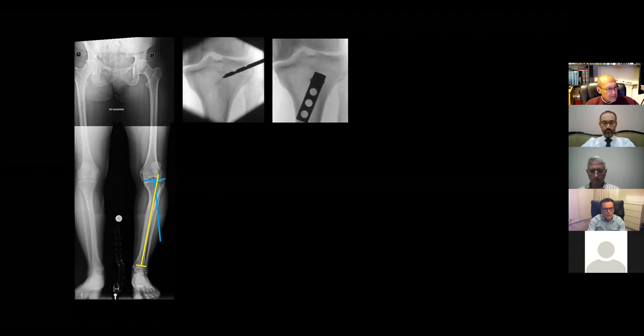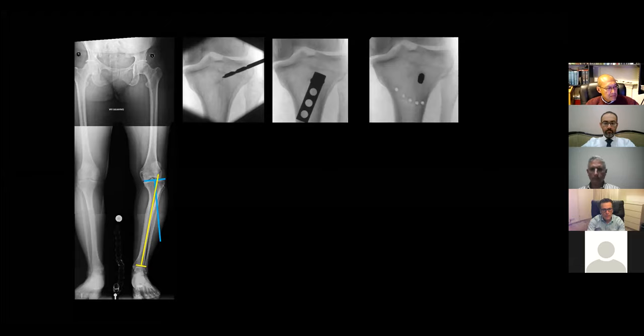Now, in this case, we're using the dome osteotomy. This is the CORA, where you can see the intersection of the two lines, and ideally the CORA should be the center of rotation and angulation. The way this method works is by placing a pin exactly where you want the center of the deformity to rotate. And then you can perform it using a Rancho cube from the Ilizarov tray.